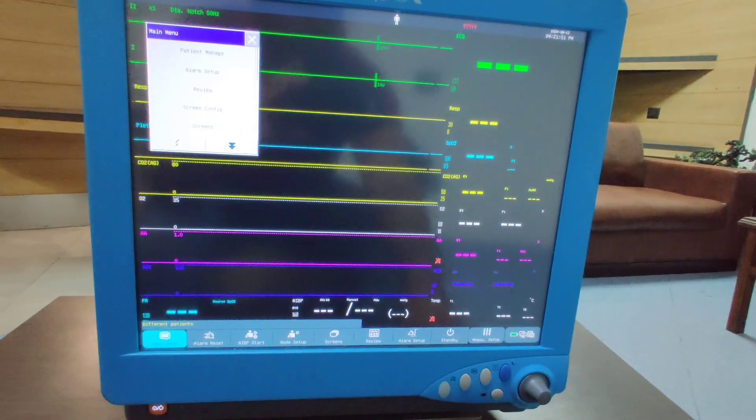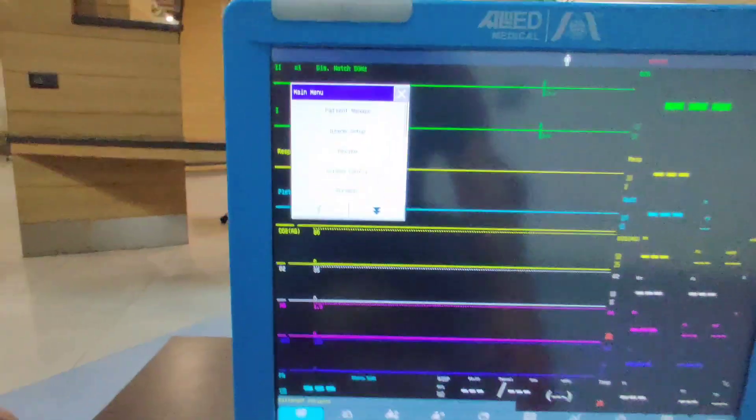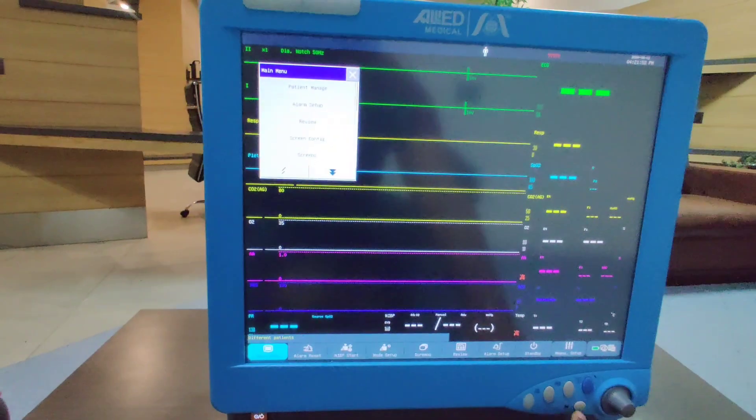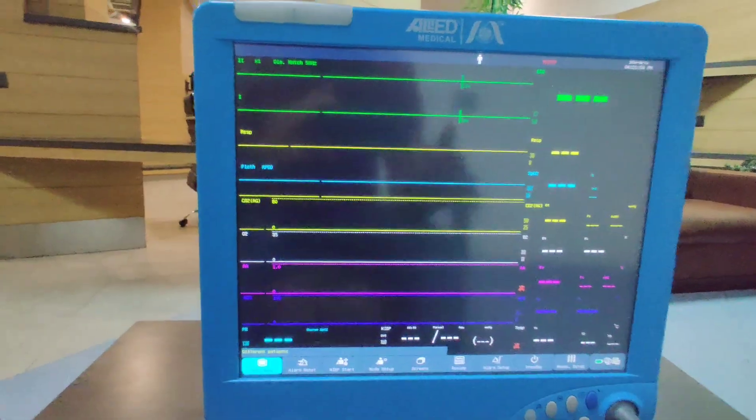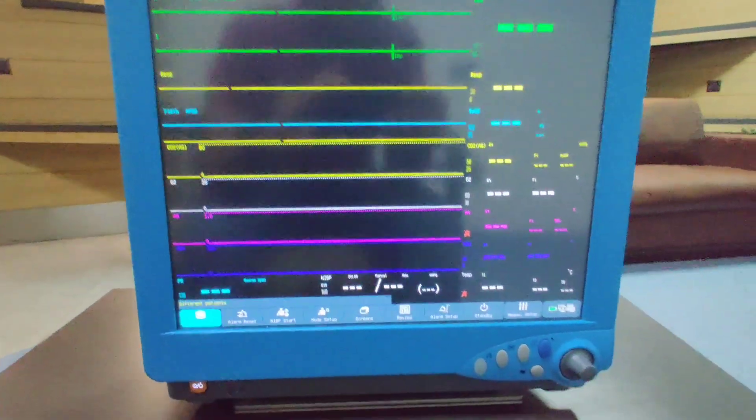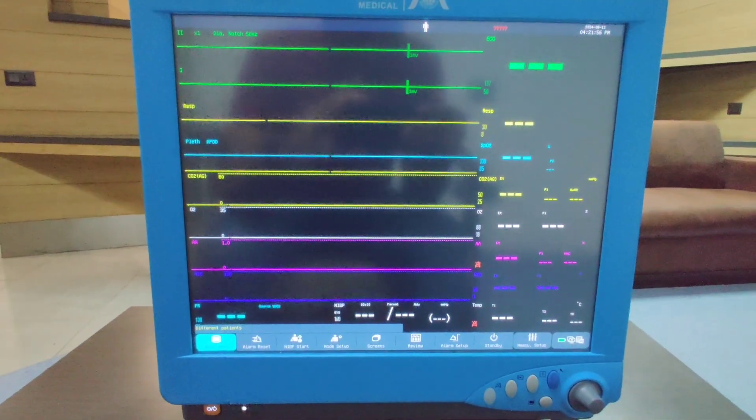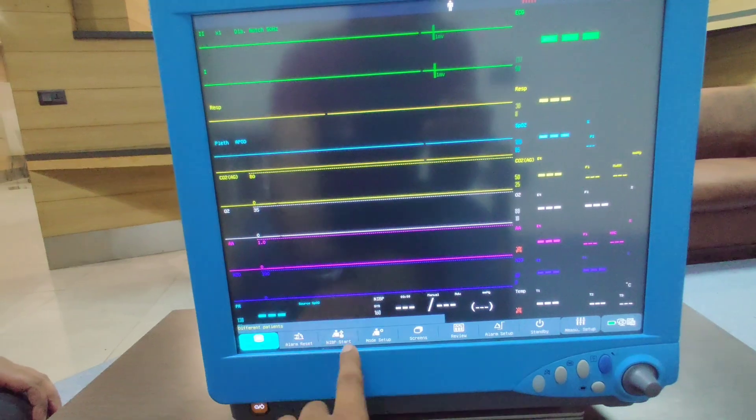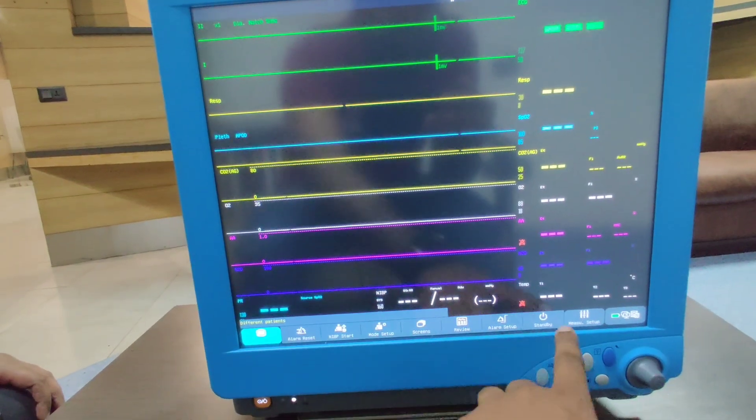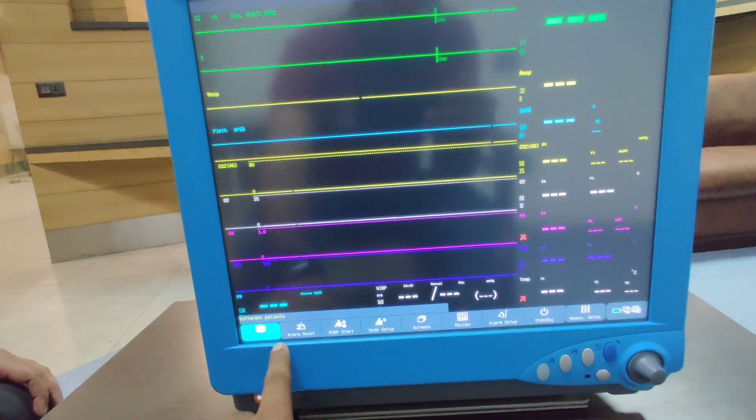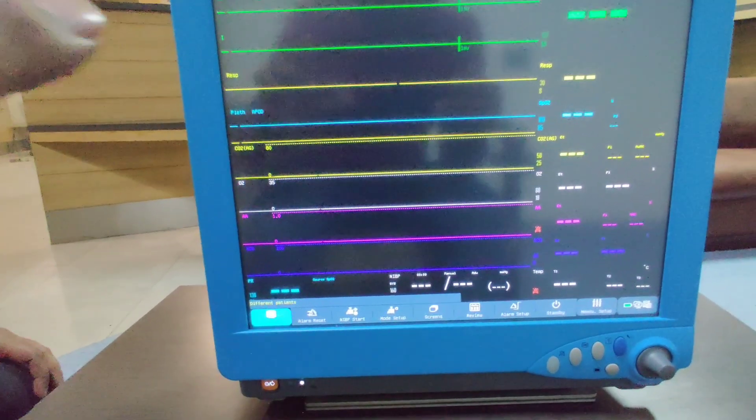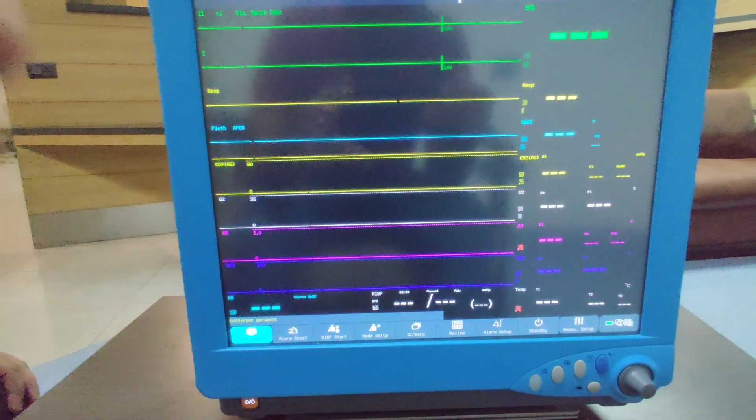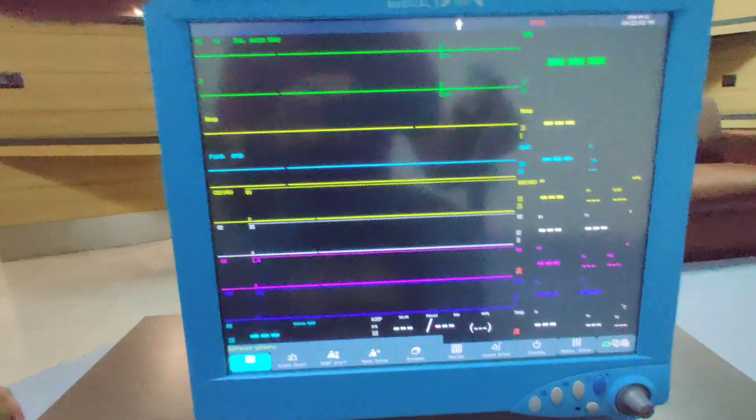As I mentioned, this is a touchscreen monitor, so we have all the shortcuts in the touchscreen also available on the lower side. These are all the waveforms which are coming and these are the measured values which will be displayed on the monitor.